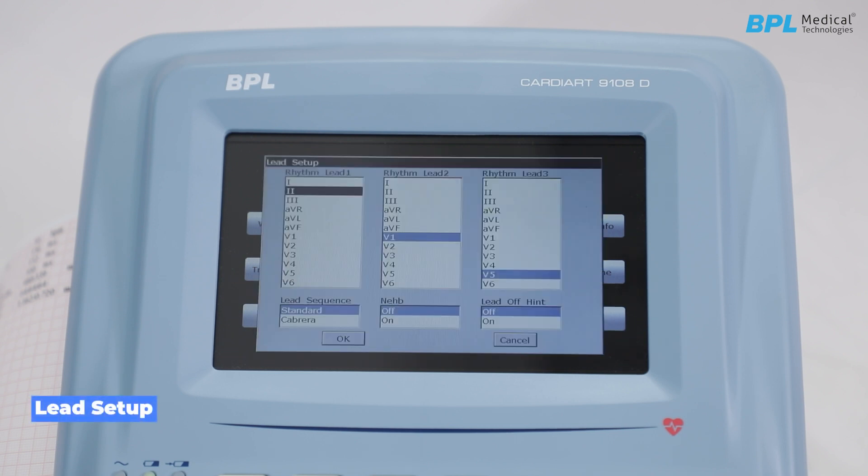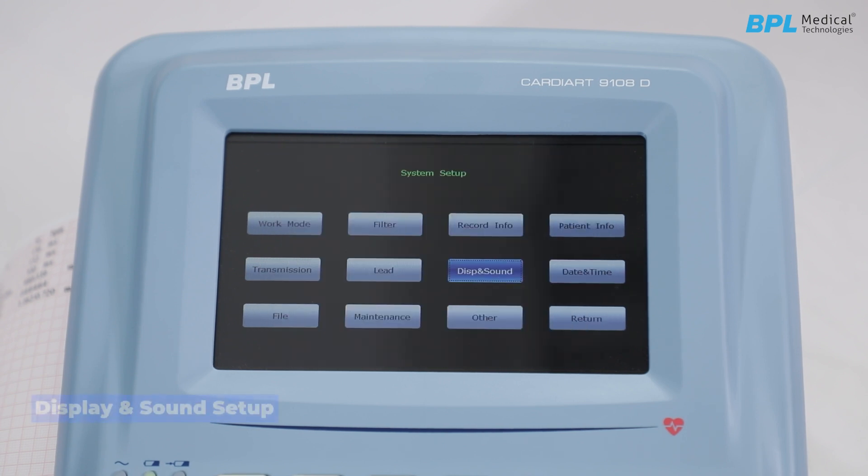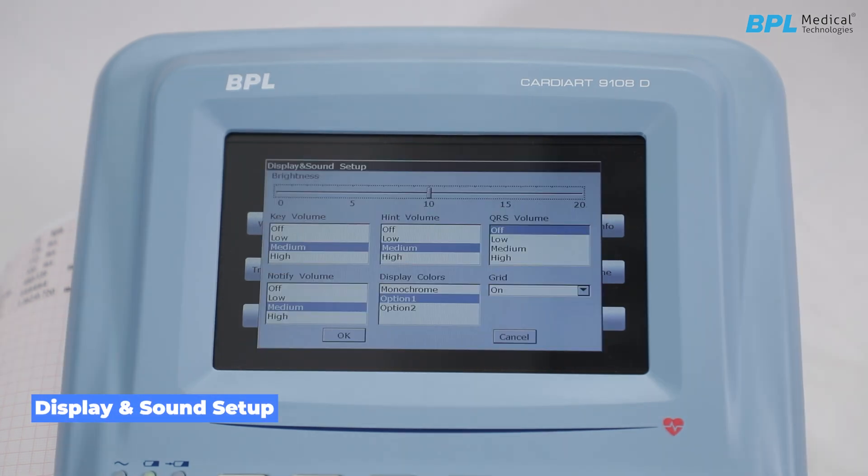In the lead setup, the rhythm lead selection can be done. Lead sequence can be chosen as either standard or Cabrera. Nehb and lead-off hint can be enabled or disabled. For display and sound setup, brightness can be adjusted from 0 to 20. Key volume, hint volume, QRS volume, and notify volume can all be set according to the user's convenience.